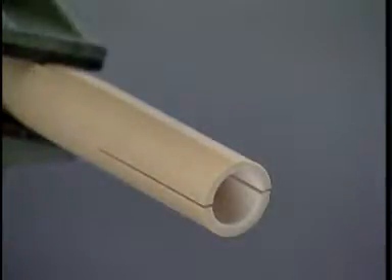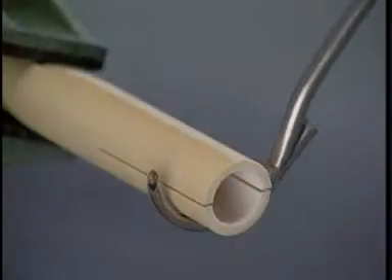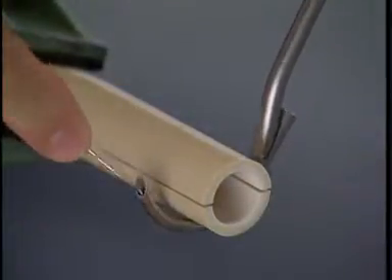Secure the bone model in the vise. Place the wire passer around the bone, staying close to the bone's surface. Insert the straight end of the wire into the end of the wire passer.